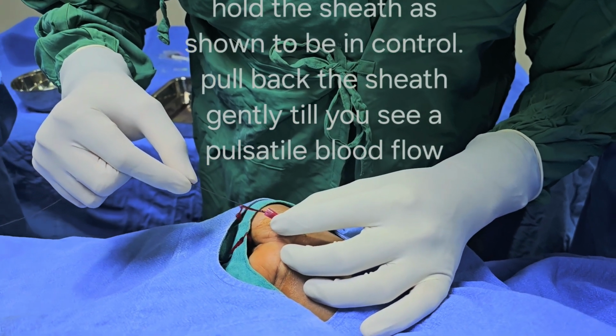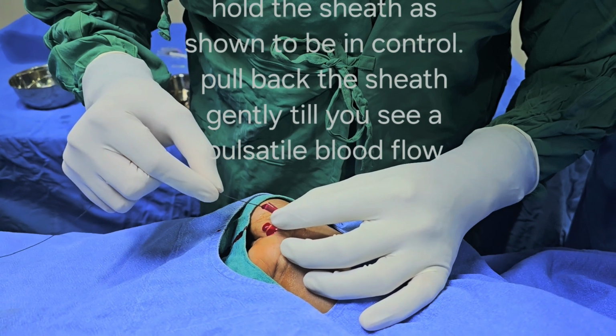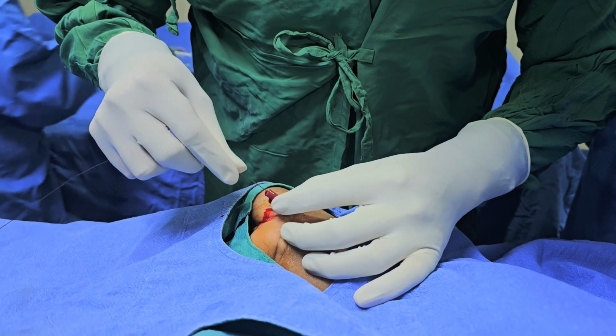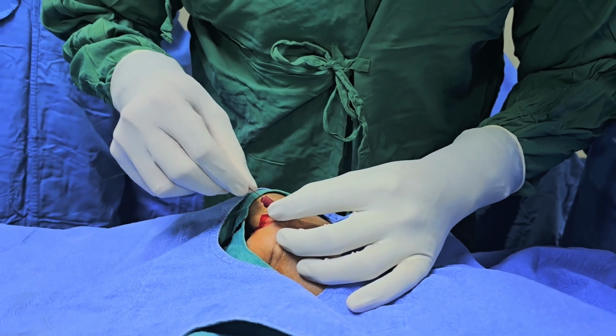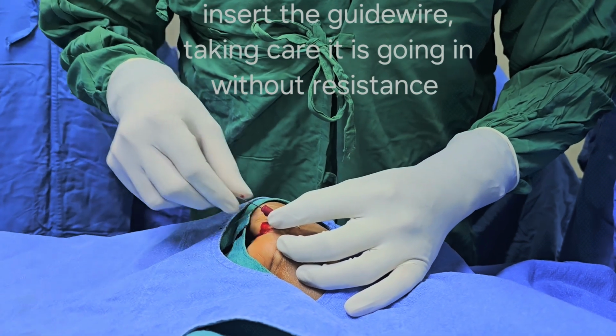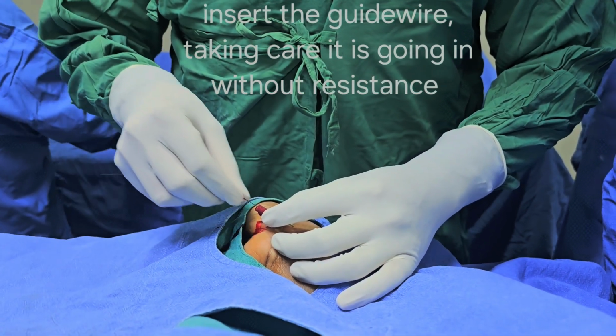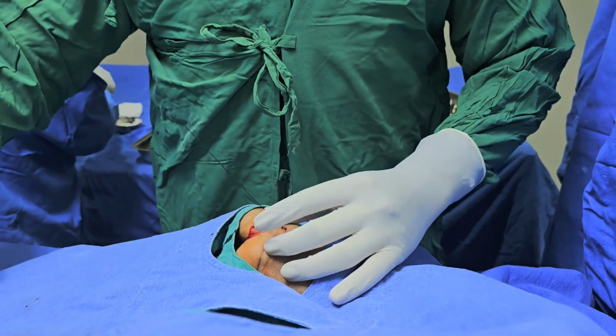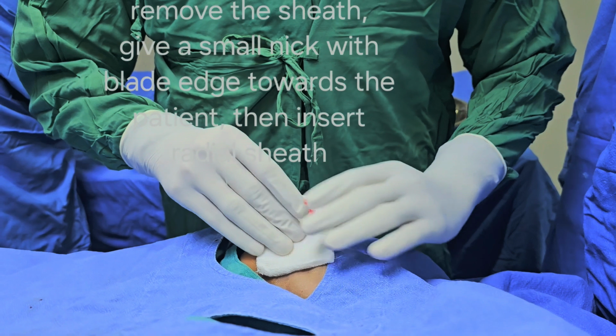Once you see a pulsatile blood flow, carefully insert the guide wire in. Make sure it's going in smoothly without any resistance. Pre-inserting the guide wire into the sheath hub makes it much easier to push it in when there is pulsatile blood flow. Once the guide wire is in, remove the sheath.